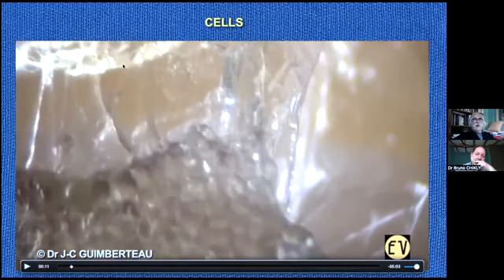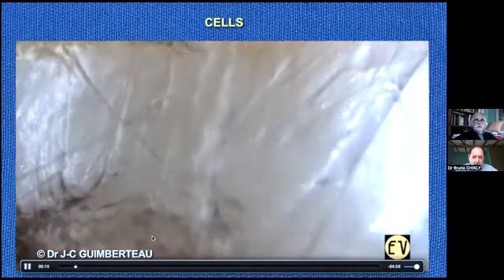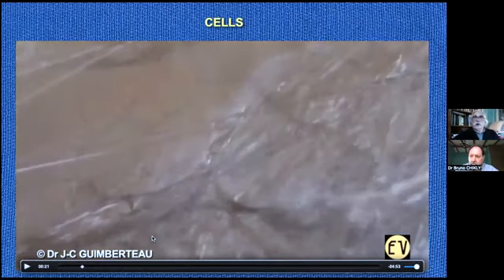Look here. All the cells are in connection with the fibers. All of them. You see the fibers? They penetrate inside the fatty lobules, inside all this organization made of cells. But again, we don't see too many vessels. Those are the bluish ones. We will see some vessels. Here, look here.